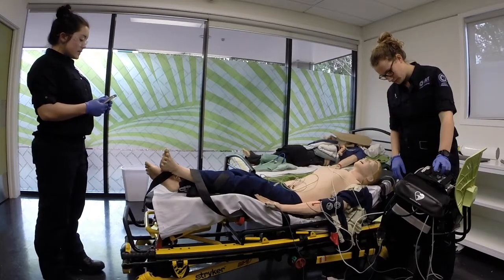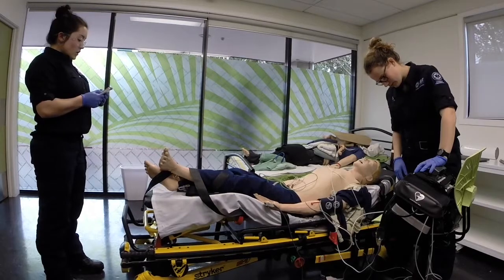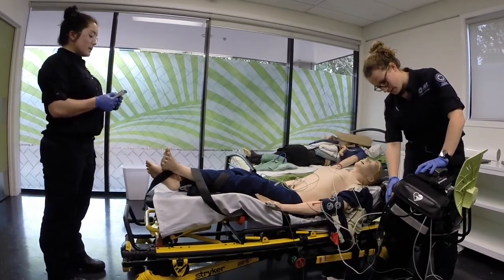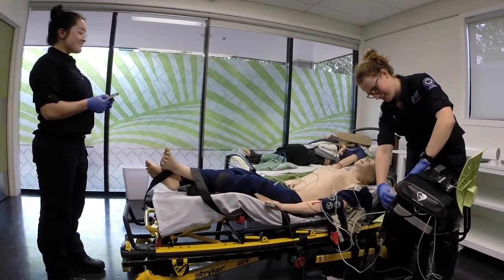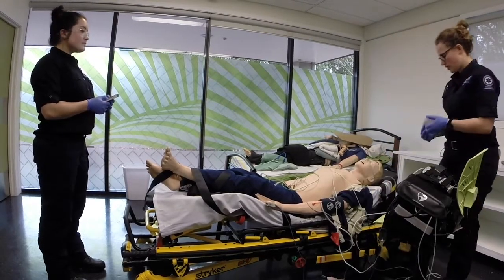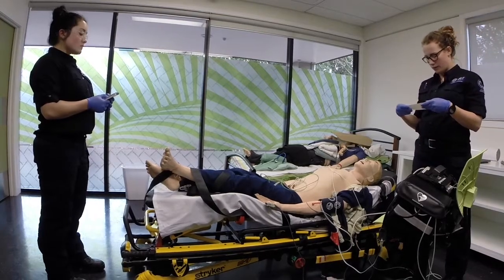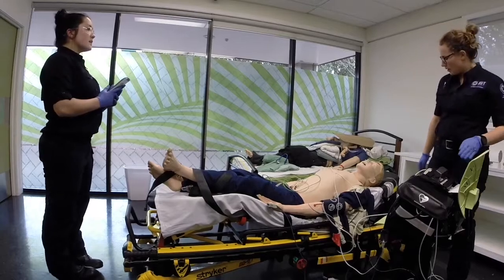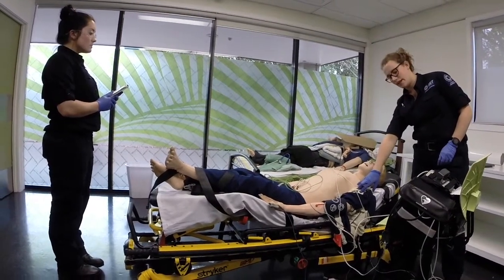Select synchronized mode. Yep, so we're syncing. Confirm there is a detection symbol above every QRS complex. Yep, so I'm printing that out. Cool, so there's a little triangle above all the QRS complexes. So, ensure the patient has received adequate sedation if indicated. So is that pain still decreasing? Yeah. Yeah, cool.